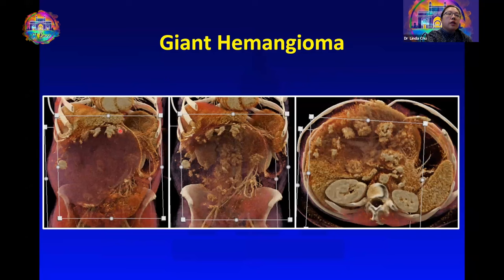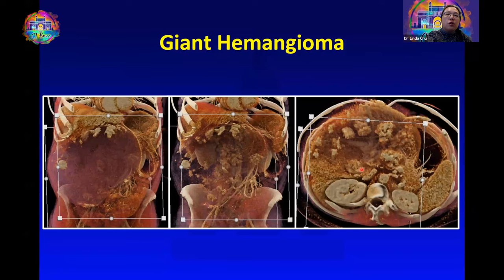Here's the lesion again on cinematic rendering where we can appreciate the peripheral nodular enhancement. We can also adjust the windowing to make the central portion of the lesion transparent so we can look all around and really appreciate the peripheral nodular enhancement pattern.